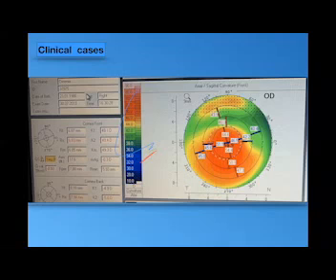The next is 50. So if we measure the mean K, we will decrease the effect or the impact of this center point. If we calculate the mean of 40 and 44, it will not be matching with the 45. In the same circle, the same point is considered. So the difference is high.